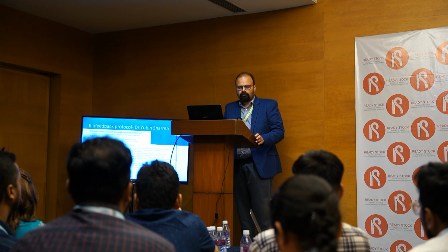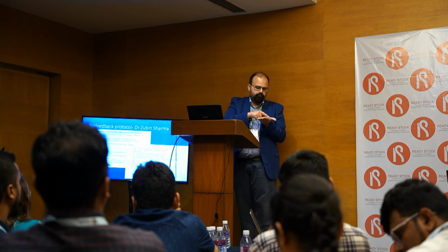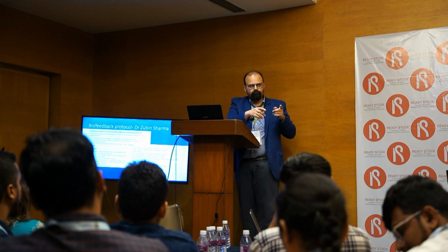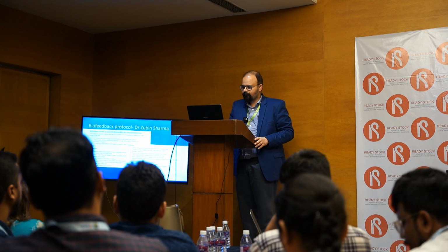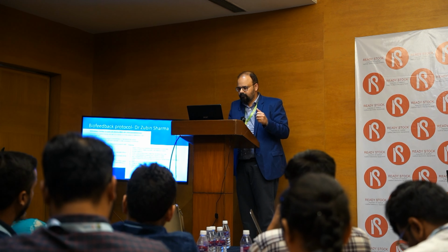That's what I do. Two screens. If the patient is lying like this, I am here, my screen is on this side, and the patient is facing the screen on that wall. So that is very easy for him to see, and if possible a large screen for him to read whatever is coming and to hear whatever is coming. Correct. You tell them regarding the posture. Obviously, you have to explain to them.